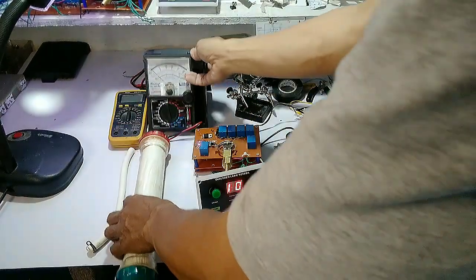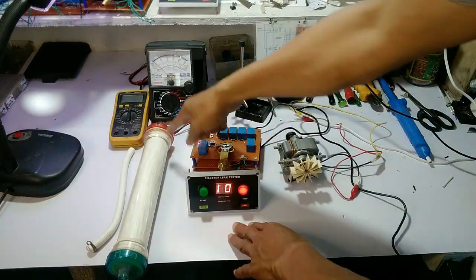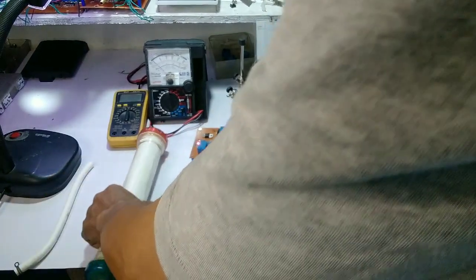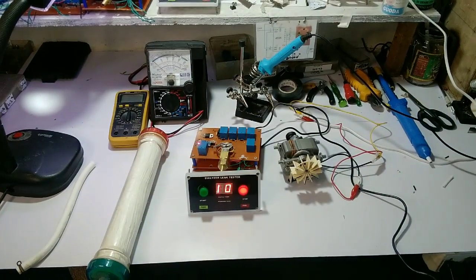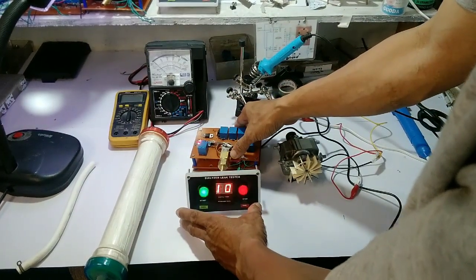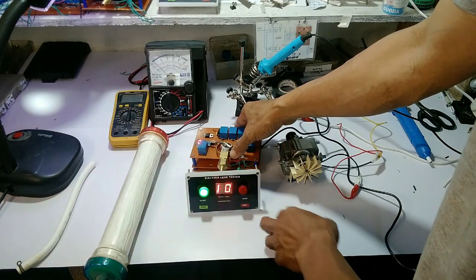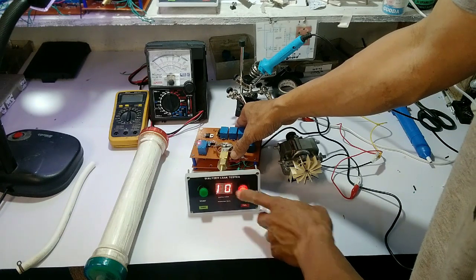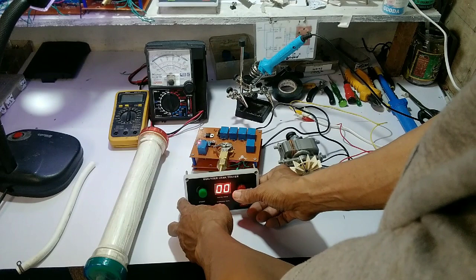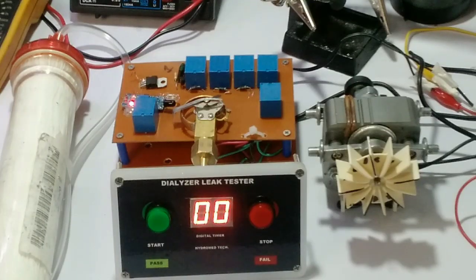Ito po ang example ng dialyzer na ginagamit sa dialysis. Ito po ay tinetest kung okay pa at kung wala siyang leak gamit ang dialyzer leak tester. Makikita nyo po, nagiging green siya at pumupula. Pag green siya, ibig sabihin walang leak ang dialyzer; pag pula naman, may kaunting leak at maaaring hindi na pwedeng gamitin.